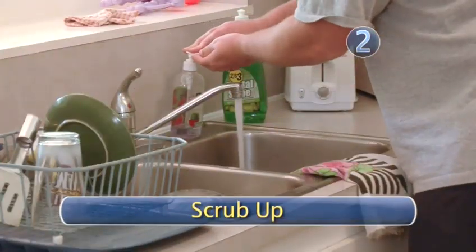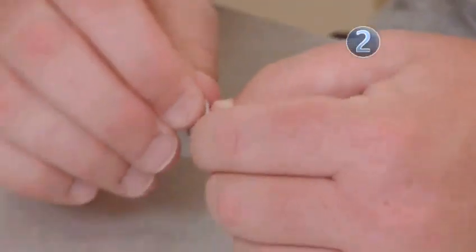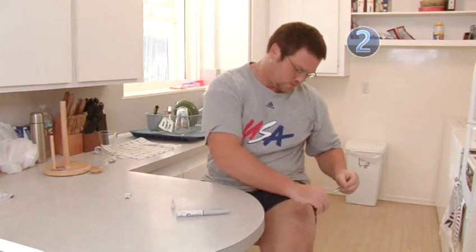Step 2. Scrub up. Wash your hands and dry them thoroughly. Then, clean your injection spot with the alcohol prep pad. Let the alcohol dry on the skin so it doesn't sting when you make the injection.